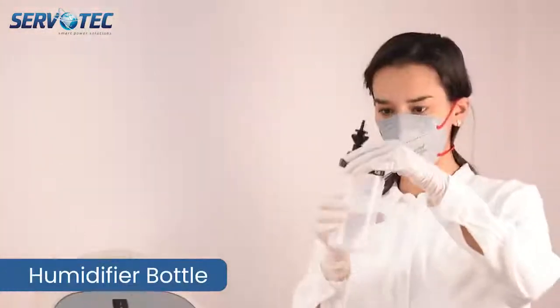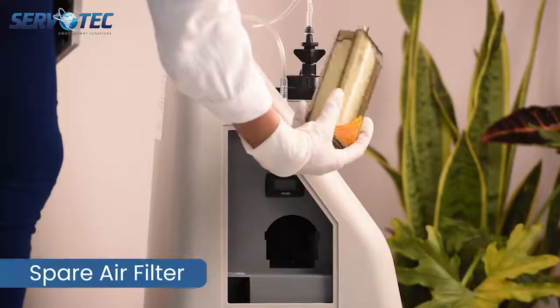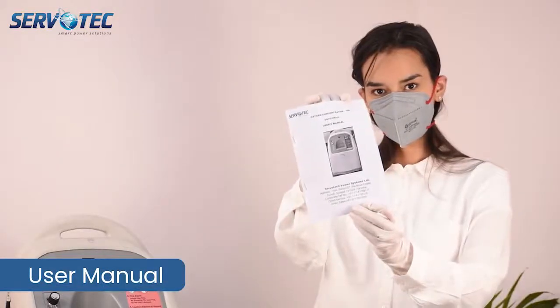This is humidifier bottle. This is humidifier bottle connecting pipe. This is a spare air intake filter and this is user manual.